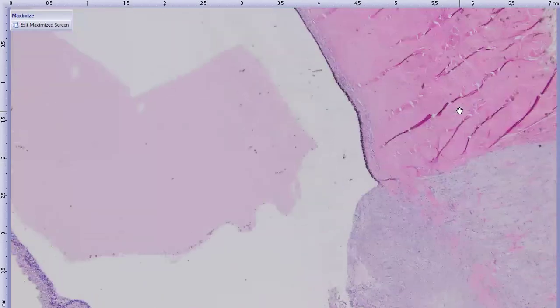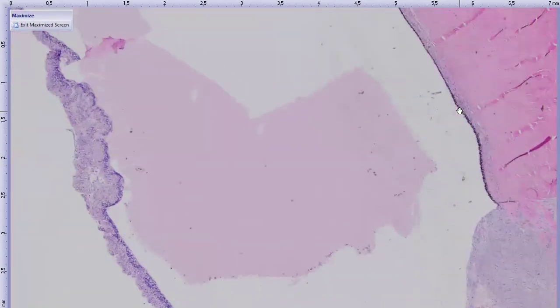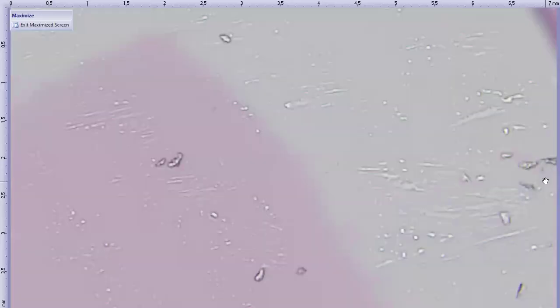And then there's definitely retinal detachment for real. So we have this area where the retina is lifted, the neurosensory retina is lifted from the RPE. We have this high protein fluid in between the RPE and the neurosensory retina. So the presence of this fluid is already helpful to confirm that it was truly an in vivo detachment. You don't usually get stuff like that sneaking under the retina artifactually, not in significant amounts like that.